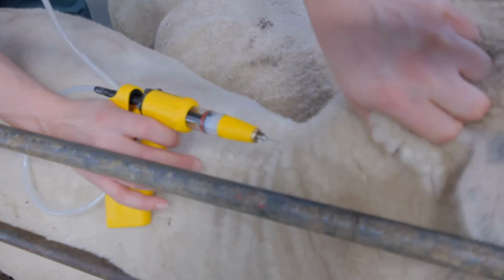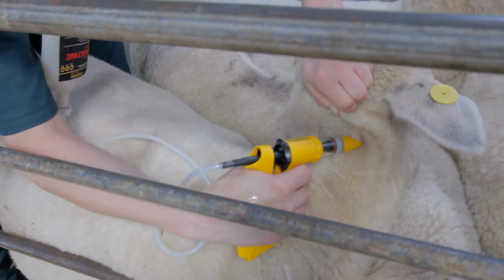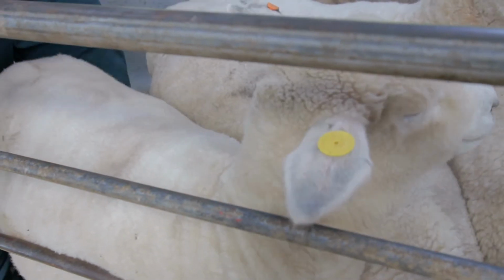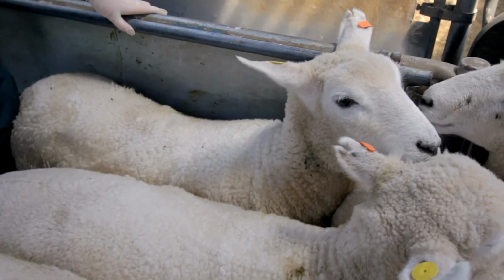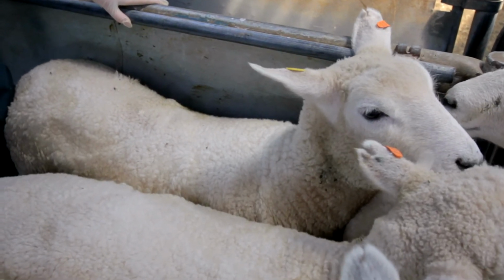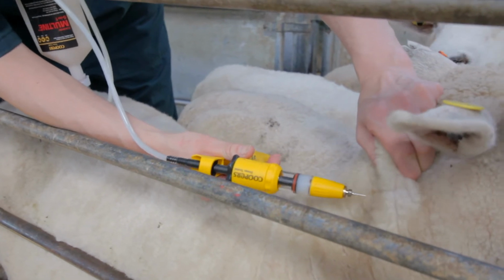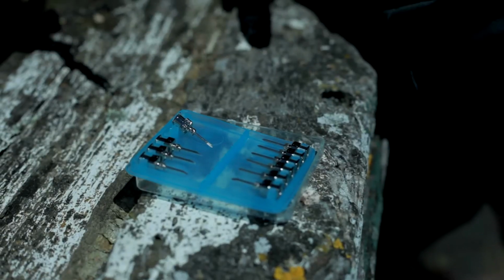Gently push the needle through the skin and depress the plunger. This should be relatively easy to do. If you feel resistance, your needle may not be all the way through the skin, or you may be vaccinating into the muscle or underlying tissues. Adjust the needle position by pulling out or pushing in slightly and attempt to depress the plunger again.